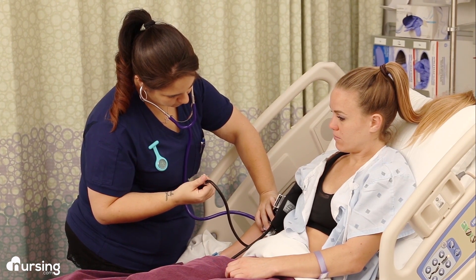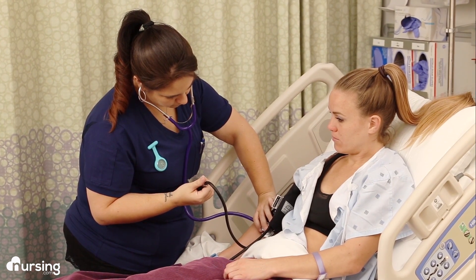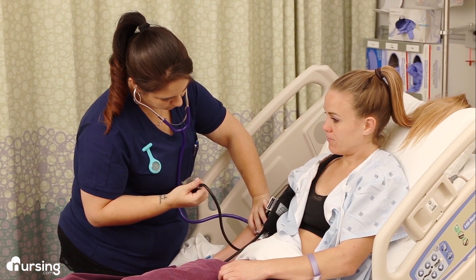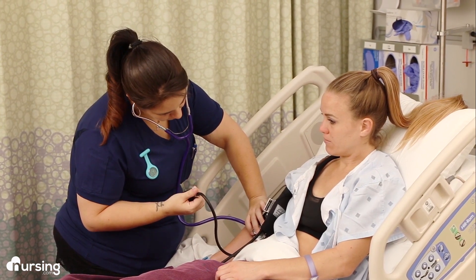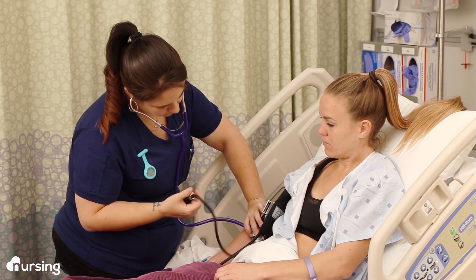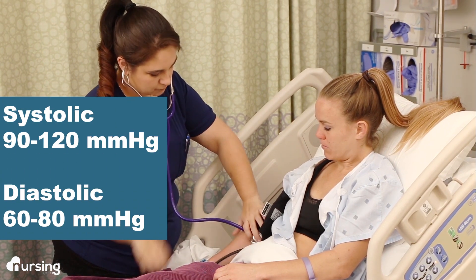Then carefully open the valve very slowly and begin deflating the cuff at about two to three millimeters of mercury per second. As the pressure drops, you're going to start hearing a "boof" sound — that's the pulse. Take note of the pressure at that moment when you hear it the first time. That is the systolic blood pressure.